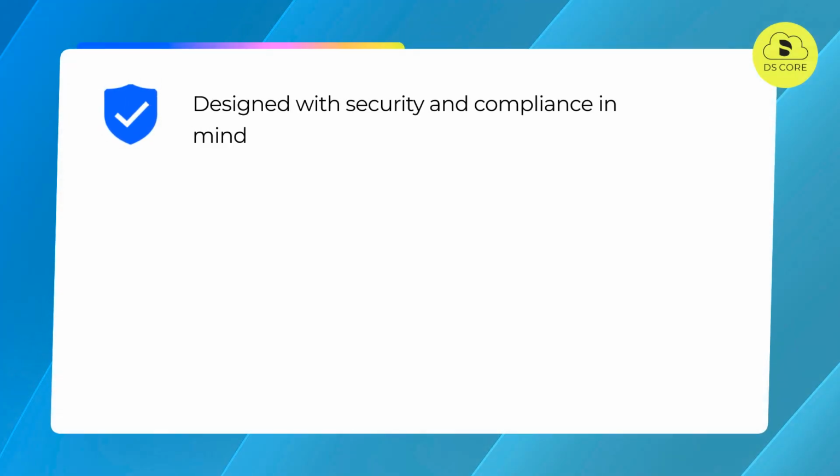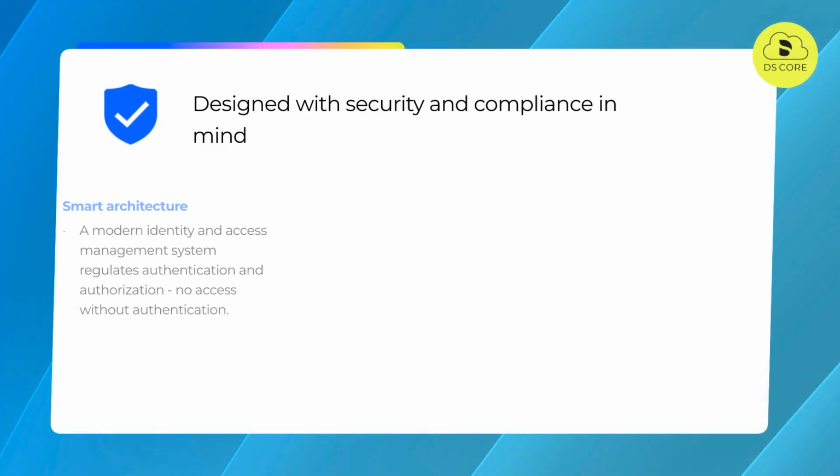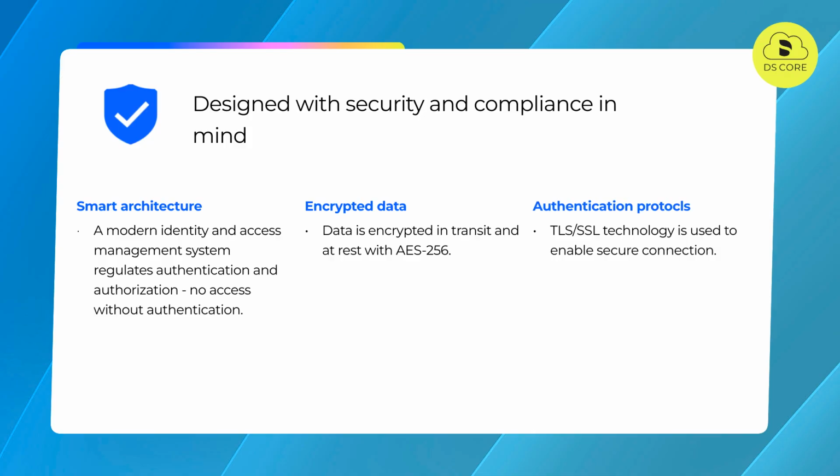DS Core is designed with security and compliance in mind. Smart architecture, encrypted data, and strict authentication protocols contribute to ensuring that your practice and patient data are protected.